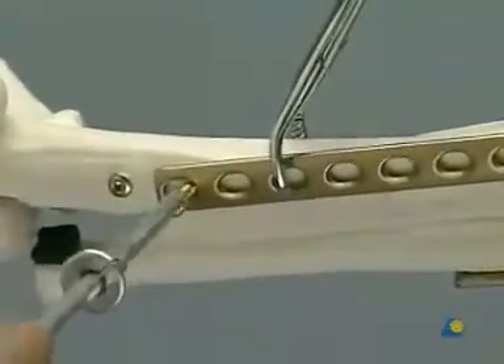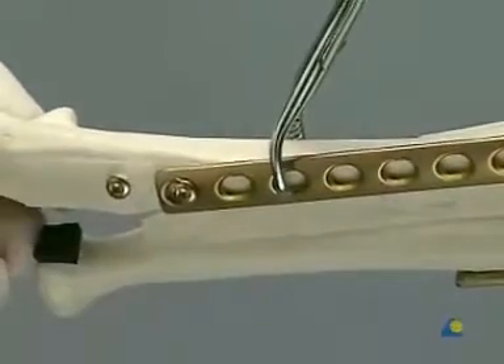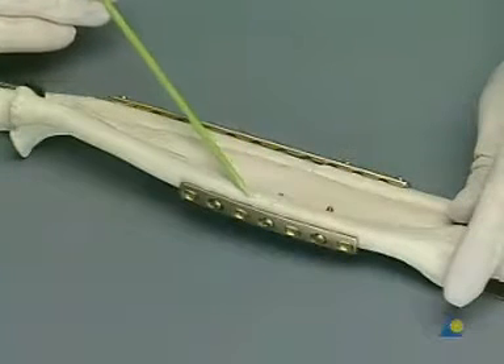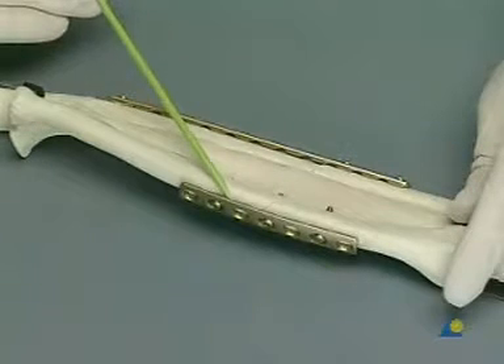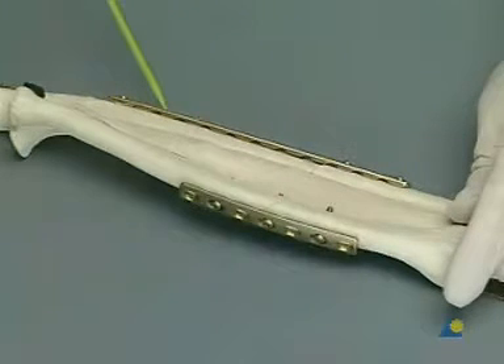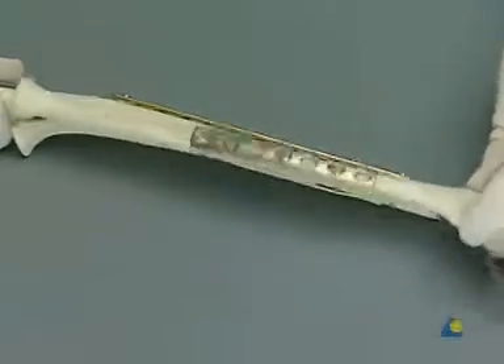The traction screw can be removed. The fragments in the fracture site are left undisturbed, in accordance with the bridge plate technique. The final configuration leaves the radial fracture stably fixed in compression with a plate and lag screw, while relative stability has been imparted to the multi-fragment ulnar fracture by push-pull reduction and bridge plate fixation.